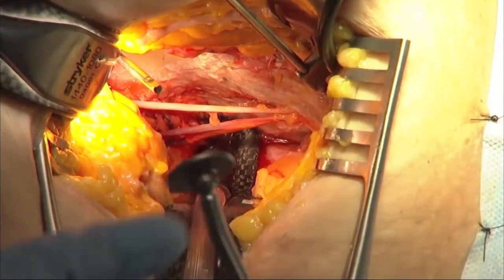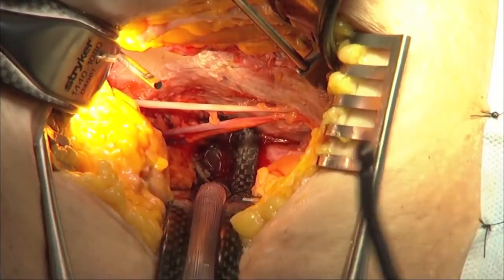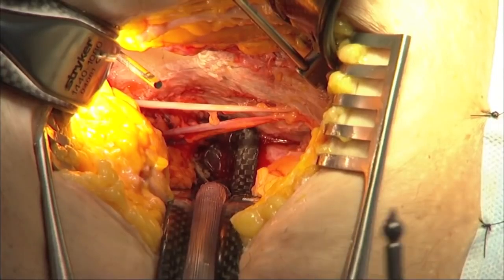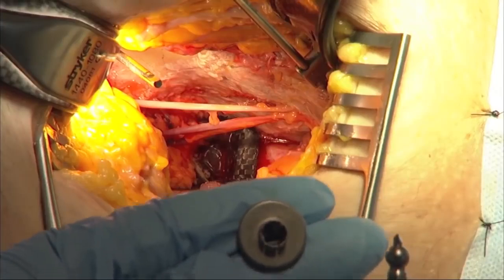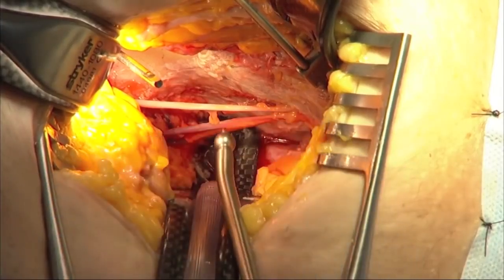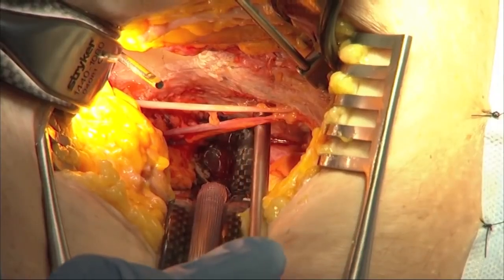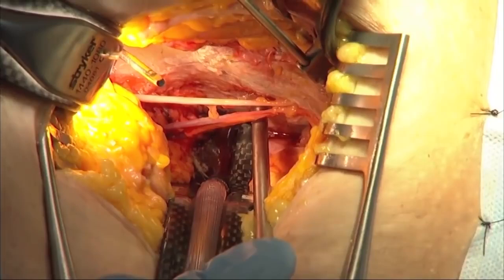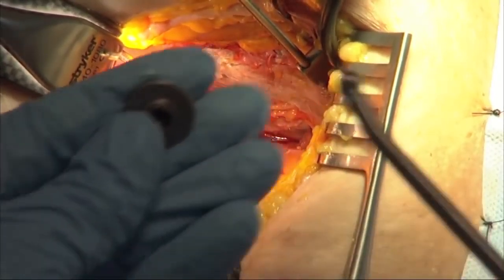Sure, absolutely. Here we've got the spike ball pusher. Some people call it a picador. And it comes with and without the washer. The reason it's bent is that it comes in at an angle. And the angle is important so that we're not skiving off the quadrilateral surface, which we're tangential to. It's a weak bit of bone. It's thin, and it can easily fracture.